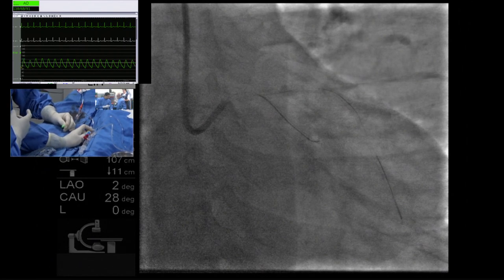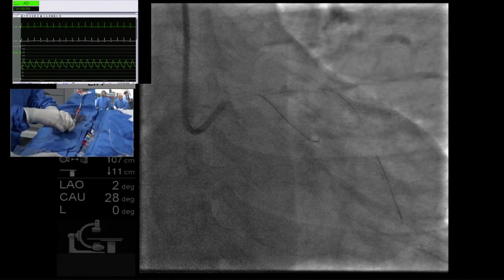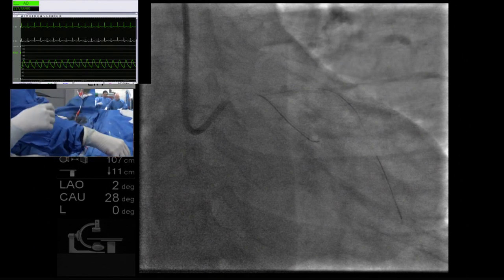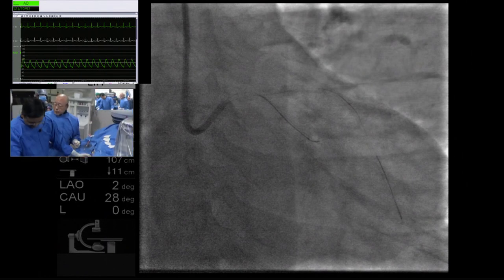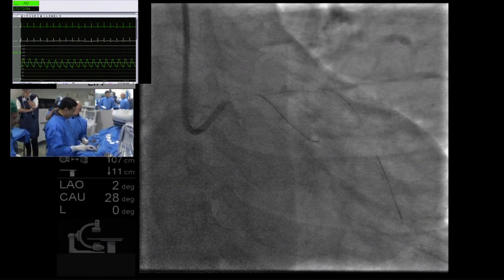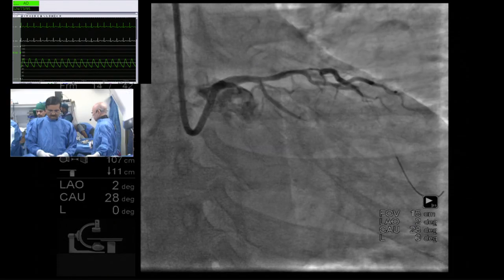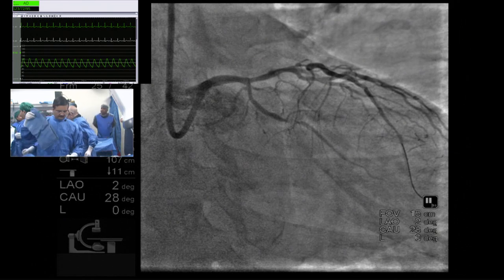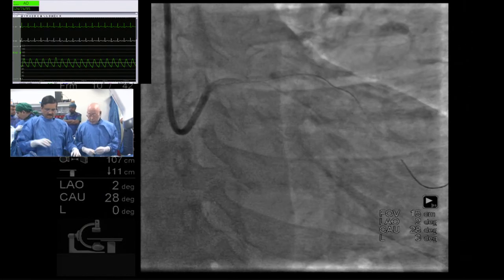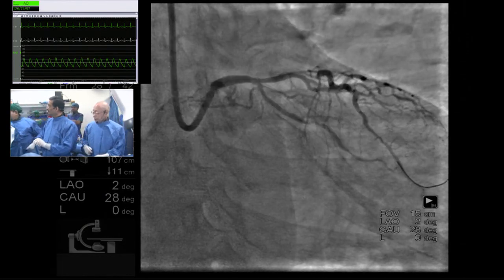Agreed. So we see that Professor Saito has taken a Fine Cross microcatheter, and the advantage of taking a microcatheter is that it allows you flexibility to change your wires, or to get your wire out and change its tip. The point has been well taken that we might need to change to a more polymer jacketed wire or something. So if you have a Fine Cross in position, you can obviously change your wires and the tip of your wires.